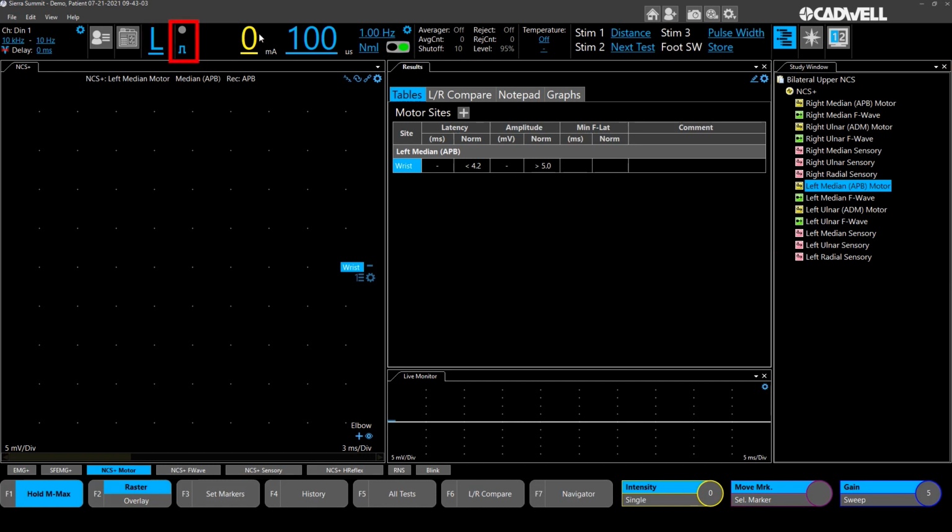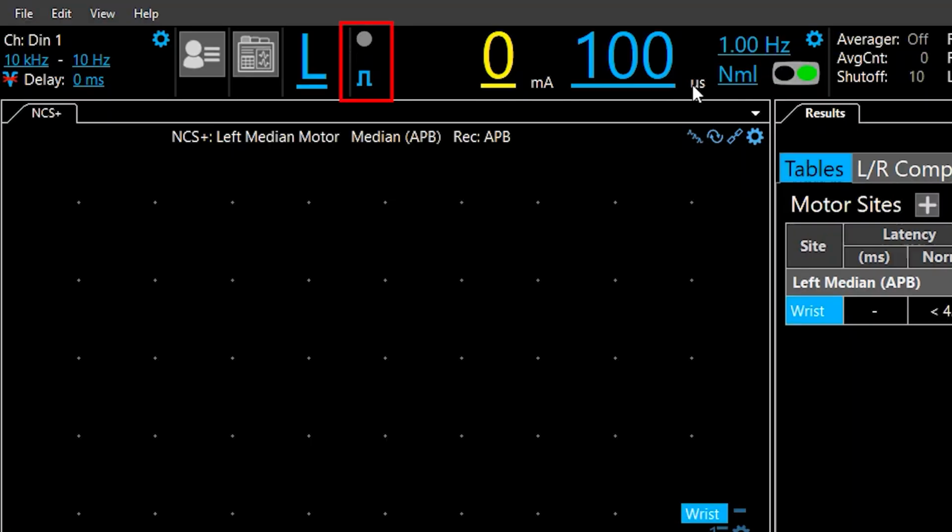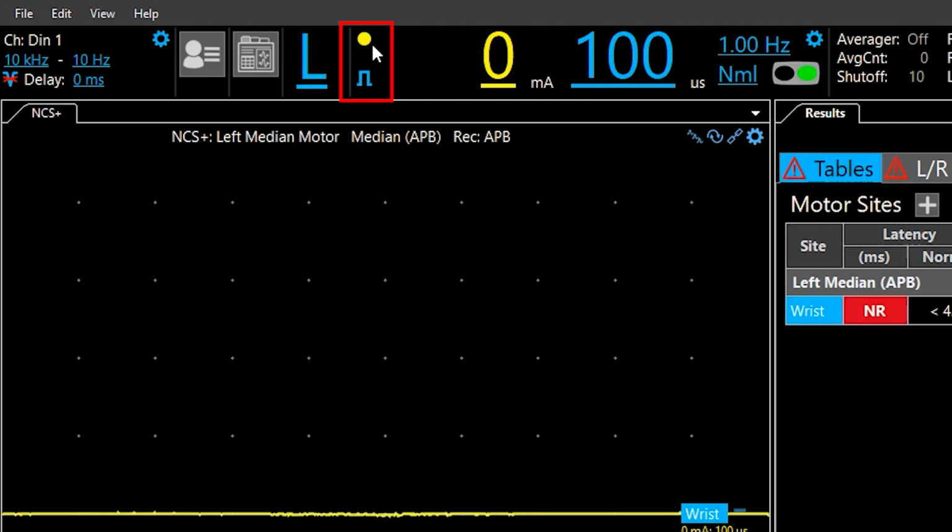This is the STIM window, or the STIM toolbar, and you'll see this will actually light up when you stimulate, the dot here that lights up yellow when you stimulate. If you have a high impedance, that will show up with a Z, and you can see that Z. You also see a number below. That number is the delivered current. So you'll notice we have the current set to 15 milliamps, but because there's high impedance, it only delivered 9.7 milliamps.